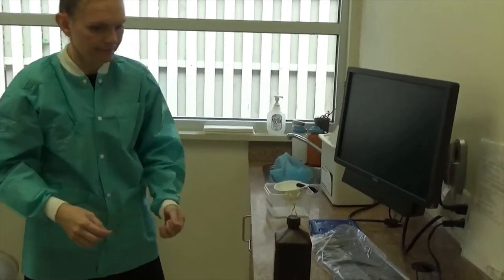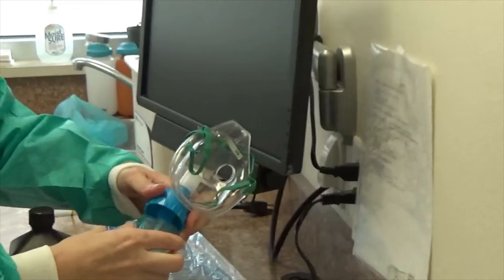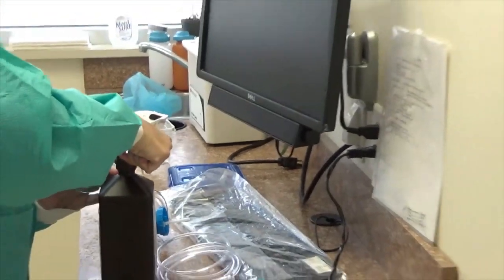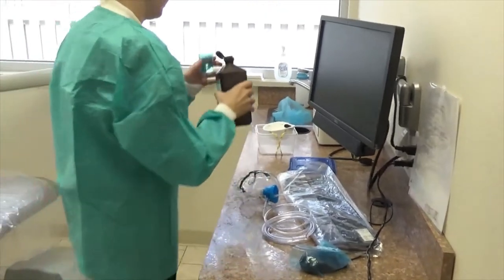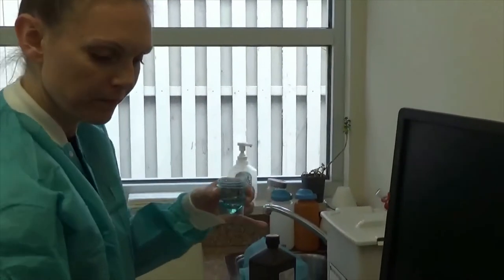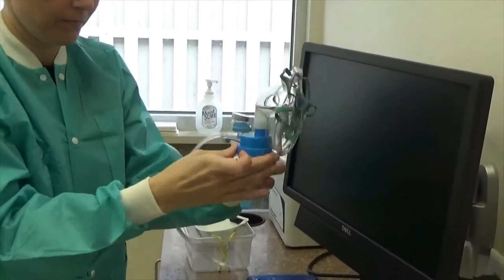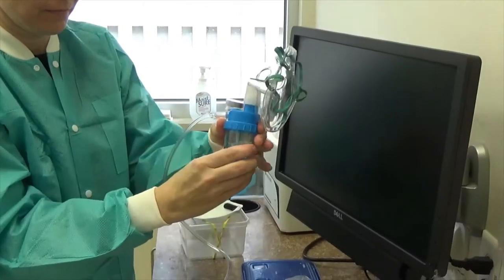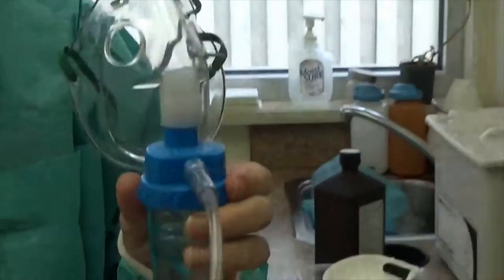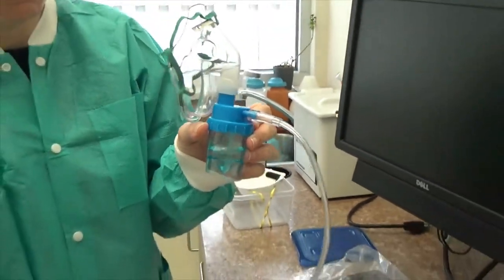You're now going to take your nebulizing mask — it's all one piece. You can see it is a non-rebreather with an adapter for nebulization. You take peroxide; she's put peroxide into the container and she's going to reattach it to the nebulizing unit. You have placed the tubing onto the nebulizer — let me just show you right here.